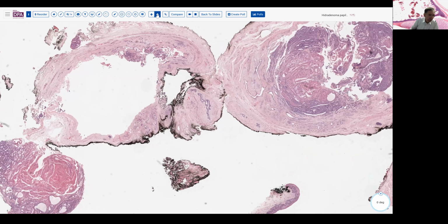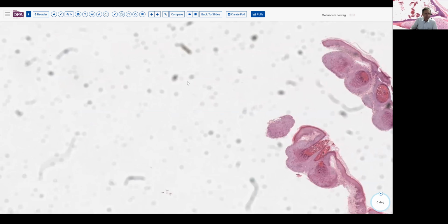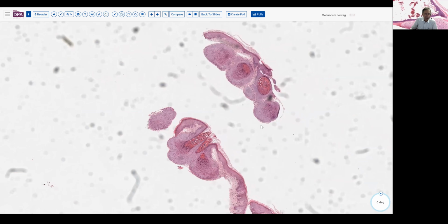All right, so going on to our next case, again, skin from the vulvar region. Just to point out that skin diseases in the vulva may or may not be specifically neoplastic. This was, again, a slight papule, as we can see, a raised area and an epithelial proliferation.